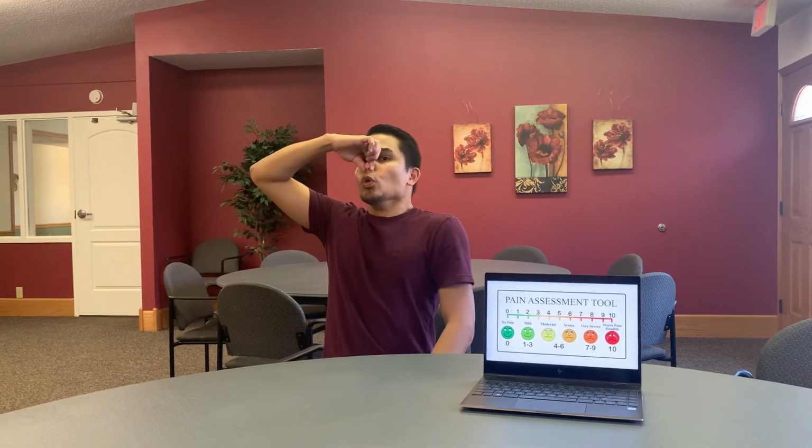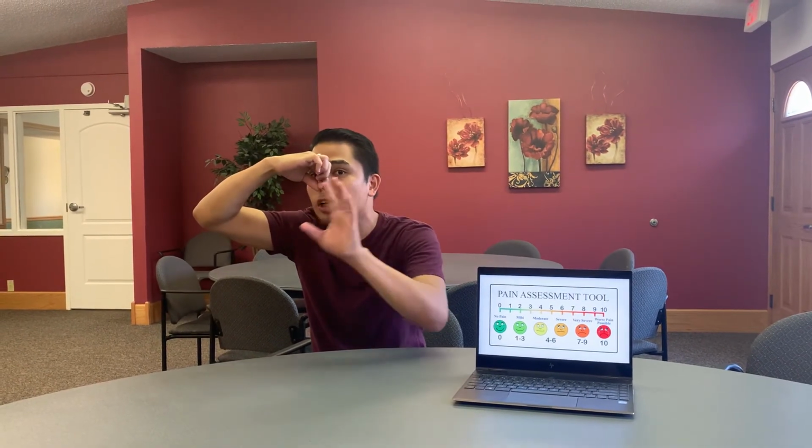So from taking a deep breath in, blow. Continue blowing hard until you feel your lungs are empty. After that, if you take note on the graph, 6 seconds, instruct the patient to take a deep breath in like that. Then we let the patient rest for a couple of minutes if they feel any dizziness or lightheadedness.